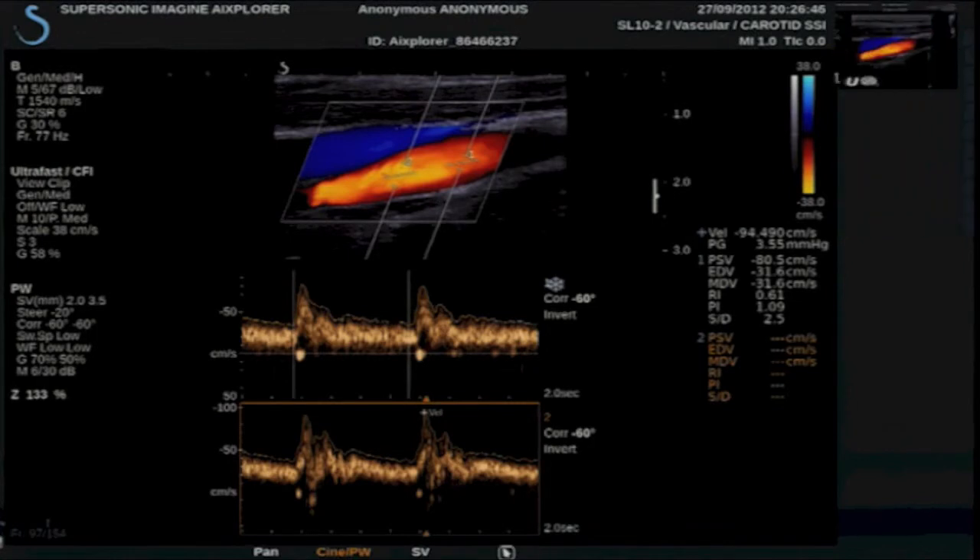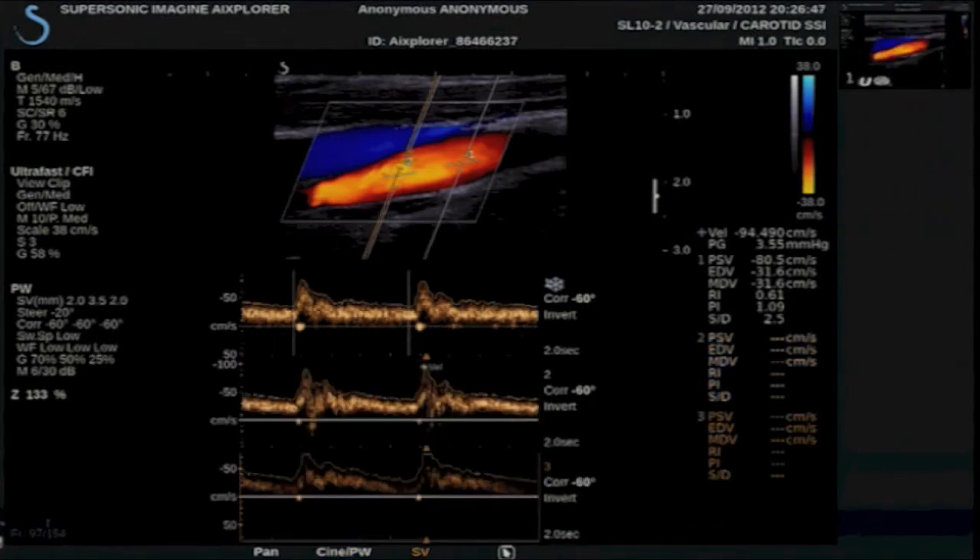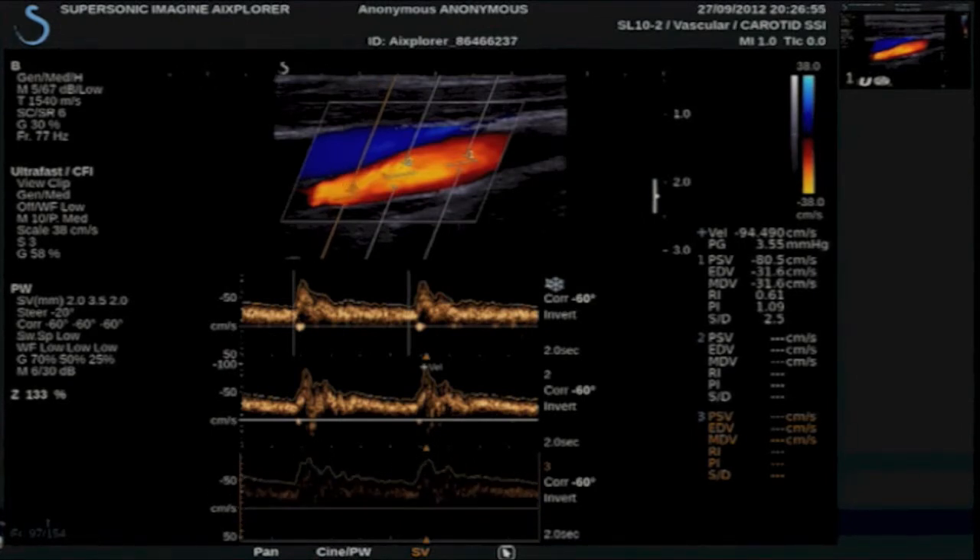I am going to add a third spectrogram, again deciding where I want to place it. There is our venous flow, that is arterial — changing the baseline, scale if necessary, and our gain.